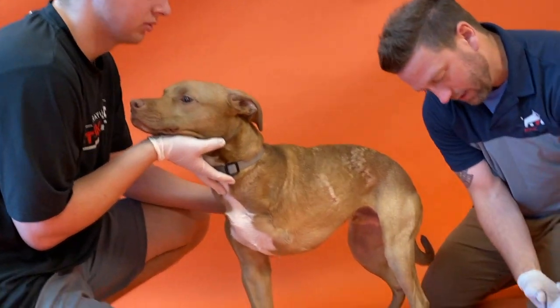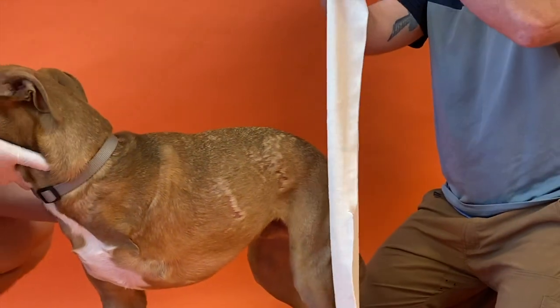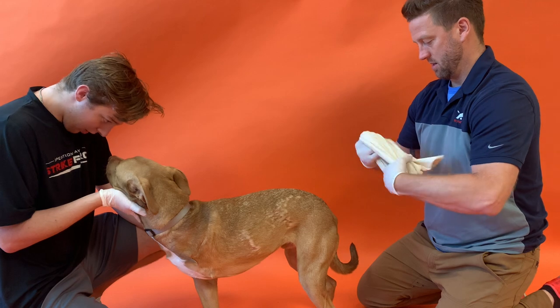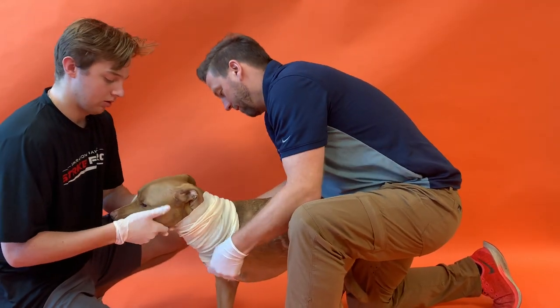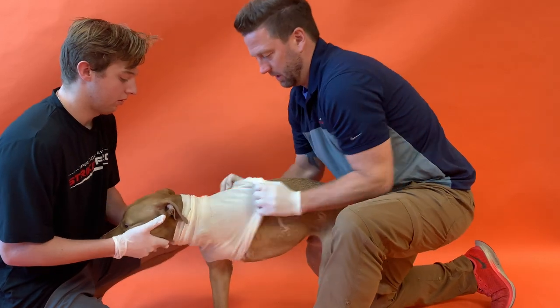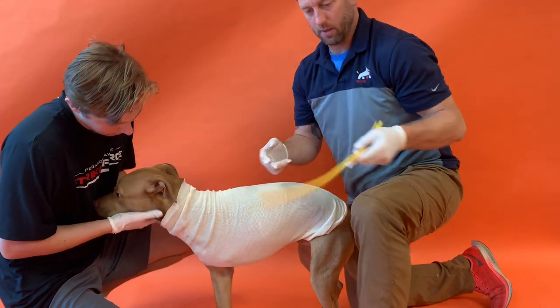We're going to start by putting on your gloves — we'll be working with fiberglass. Cut one single slit in your stockinette and put it over the dog's head. This acts as an interface so we don't get any casting material on the dog. Put the good leg through the hole and slide it as far back as possible.